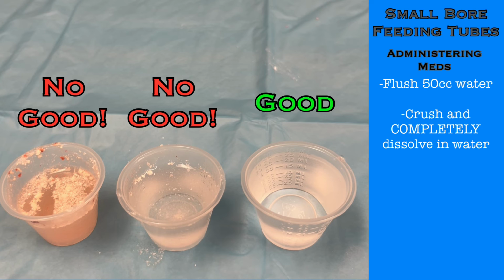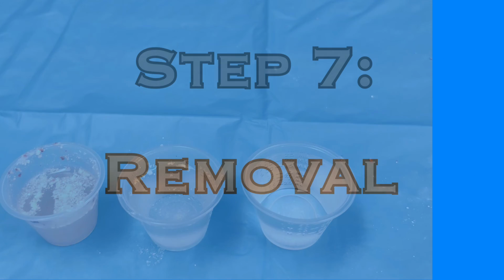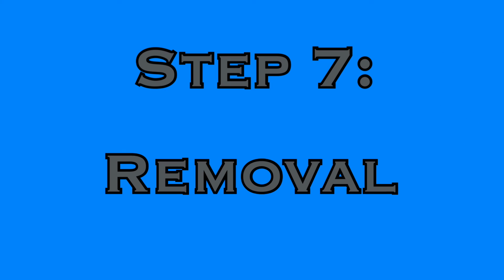Some medications are not crushable. Other medications may not be able to dissolve completely, and in those cases, those meds cannot be delivered through this tube. But if you have successfully dissolved and administered medications, flush with another 50 cc's of water to ensure the tube is clear. When the NG tube is no longer needed, removal is a pretty straightforward process.